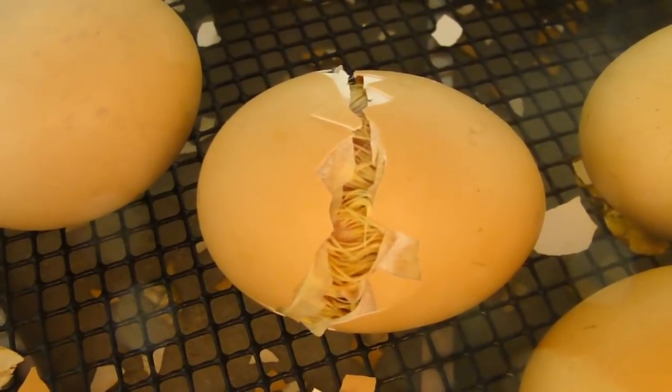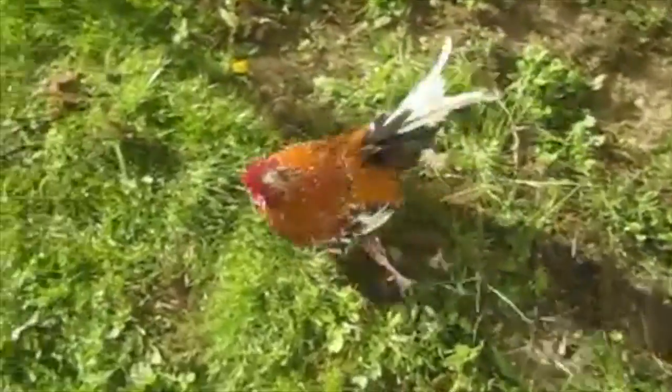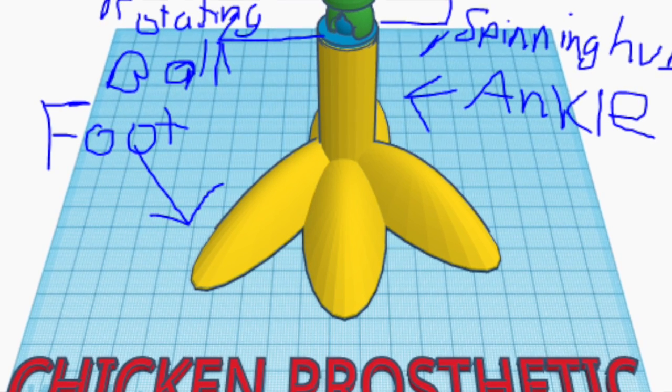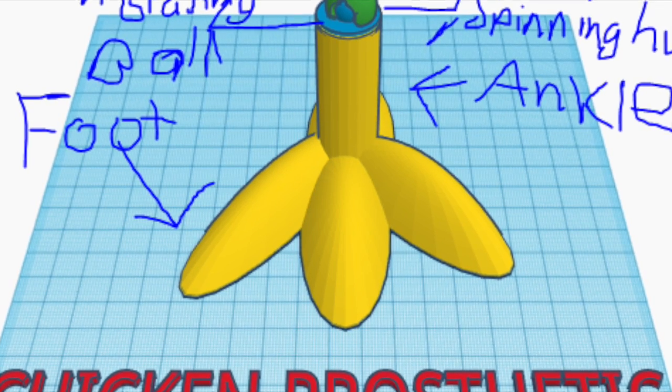We wanted to make it so that the chicken can live its daily life without any problems. Our chicken prosthetic was made in Tinkercad, designed by none other than us. We want to make it so the leg looks like a chicken leg, and in a way people will notice the difference as well, as keeping it safe for the chicken to have.